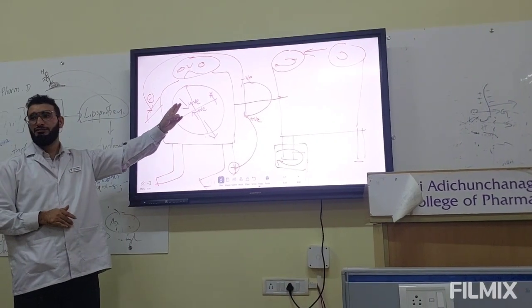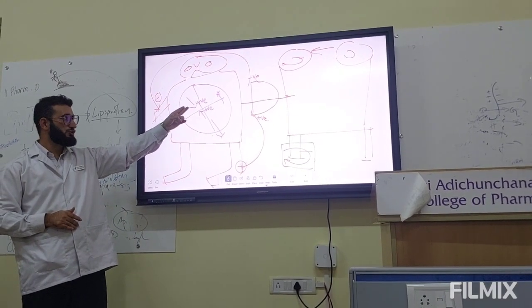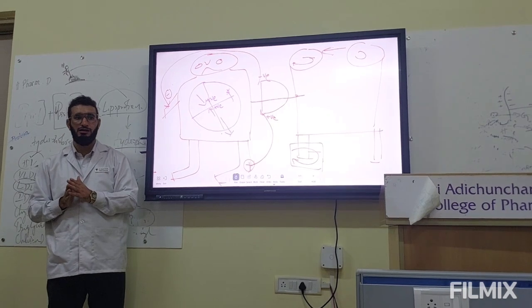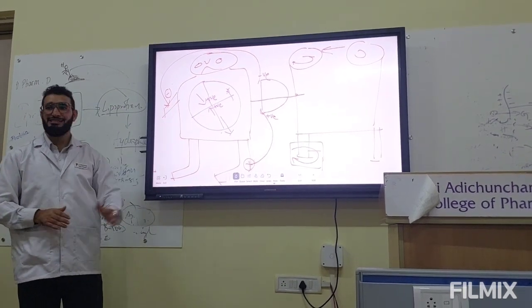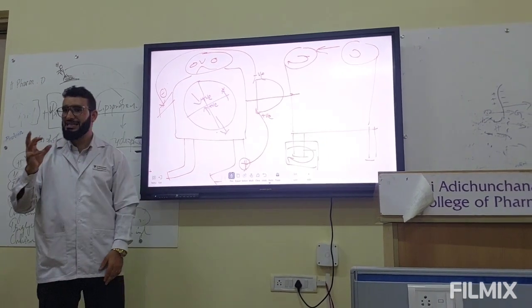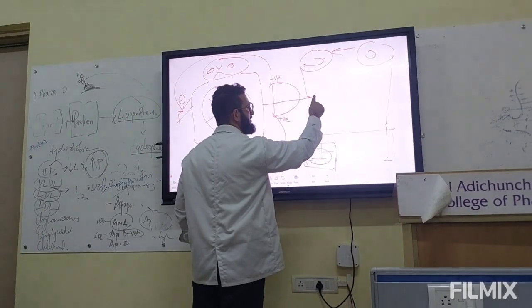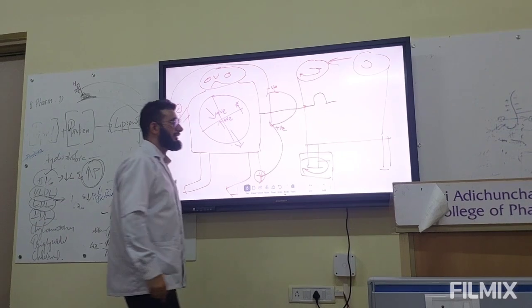During the first electrical event in the atria, the current carrying positive charge moves towards the positive electrode, so the deflection will be positive, because this is atrial depolarization. This is a slow and not stronger current, so the deflection will be positive but gradual and slow, like this. Then it will come back.